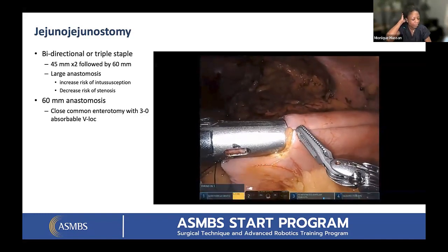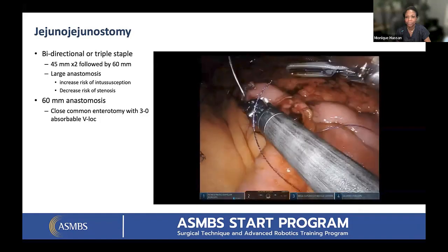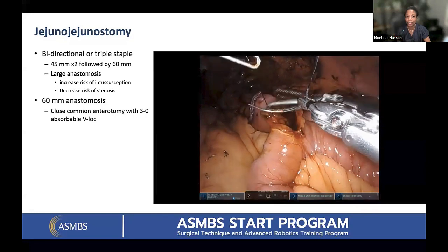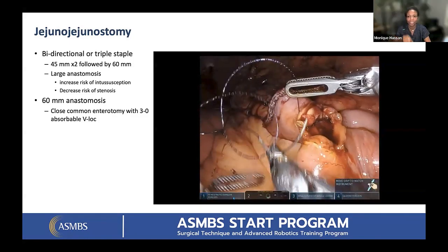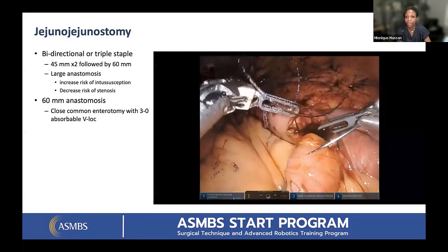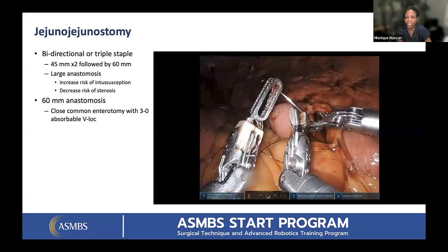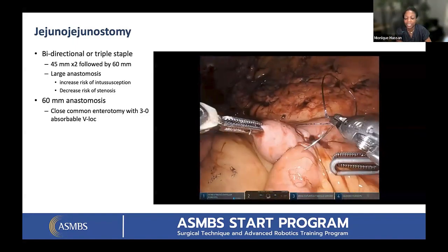The other thing I just thought of, I learned this little trick from somebody in the robotic surgery collaborative, but I put my cut and coag on 4 and 6. And so I use cut to make my enterotomy and it never bleeds and there's no thermal spread. So a little interesting. Yeah, it's super awesome. I just literally go down. There's like nothing. Your cut is at 6 or your coag, which one's which? Cut, my cut's at 6, my coag's at 4. Got it. Yeah. So I use that for my enterotomies. And so there's literally no thermal spread at all. So none of those burn marks that you see on the bowel. It's really nice. And then I do a similar technique for closure of my common enterotomy.